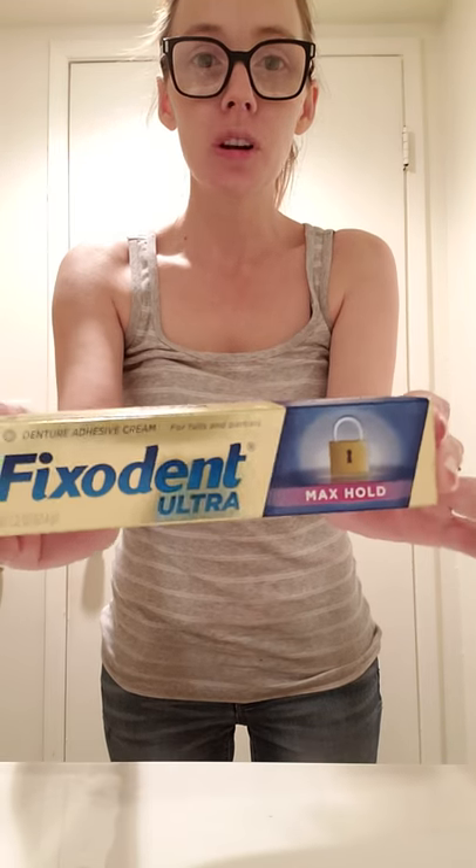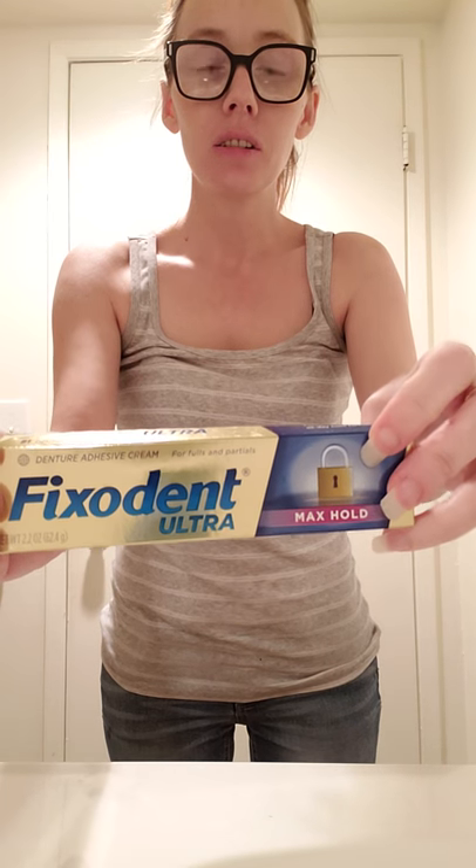I'm not going to do a whole video, but people have been asking me about the Fixodent Ultra Max Hold. It does have the lock on the box, but I just wanted to show you what I have to do to get these out — to show you the hold it has. I've been wearing them since 8 o'clock this morning. I'm taking them out because I want a hot cup of coffee and a donut and I just want to enjoy it.